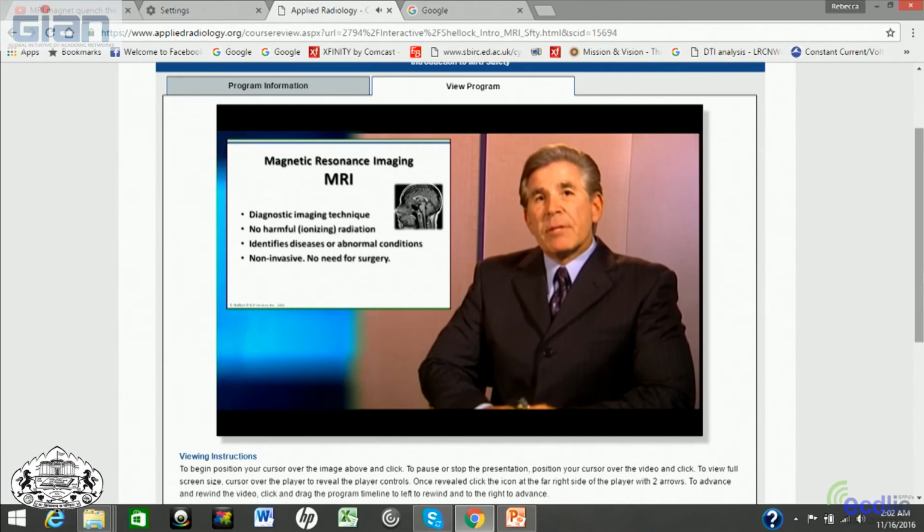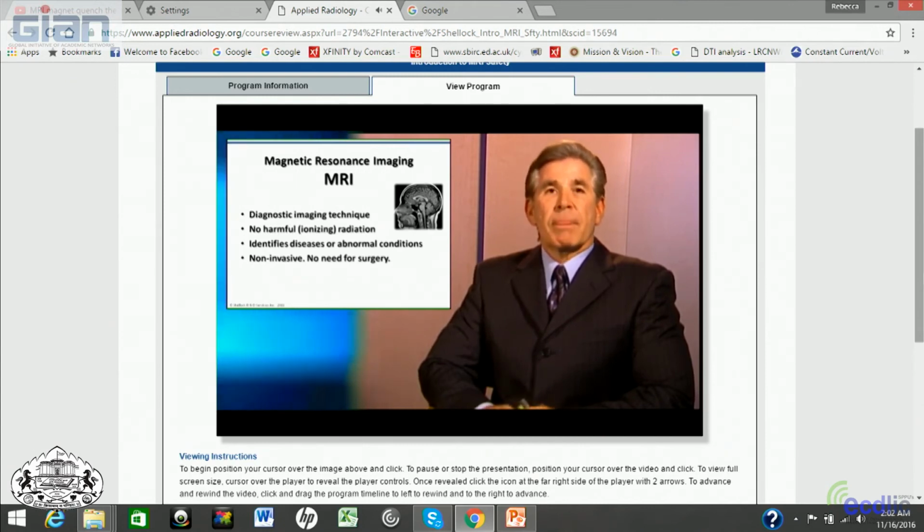With proper safety procedures and guidelines in place, MRI poses no known permanent side effects to patients, medical personnel, or other individuals. However, serious injury or death can occur, and the MRI system may sustain damage if safety guidelines and screening procedures are not carefully followed.